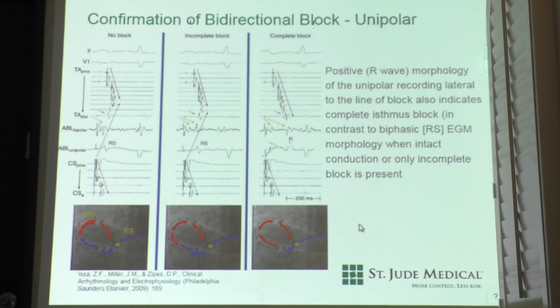And so we put pairs of electrodes all over these catheters. And when wave fronts go by them, the voltage that they perceive, because they have this already kind of a carrier voltage, allows the amplifier to pick up the difference in what's touching them. That's how an antenna works. So we can call all of these antennas. A pacing lead is an antenna in that it can receive and transmit, whether it's touching or not.